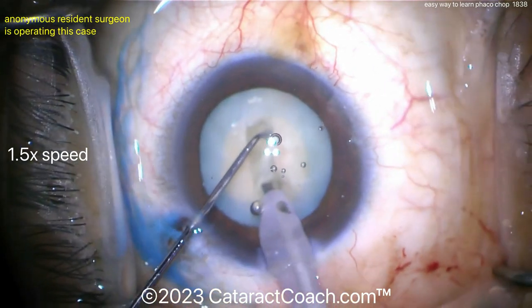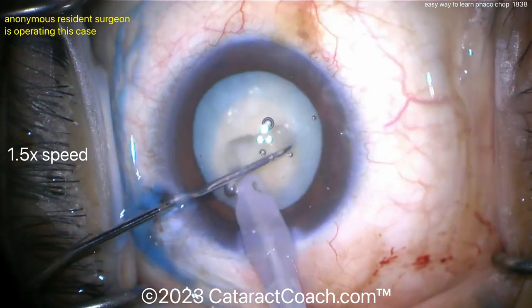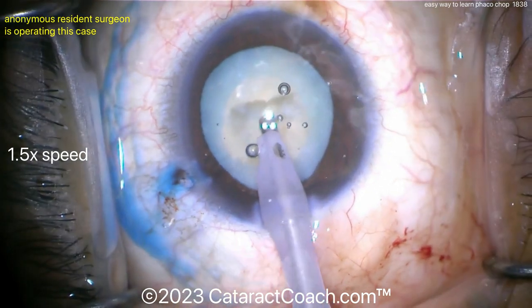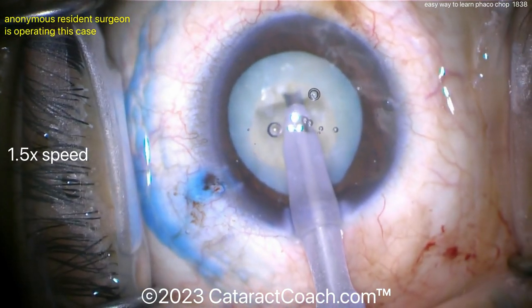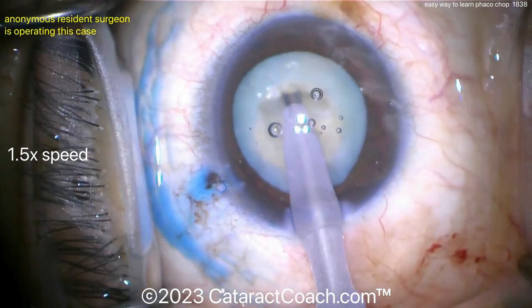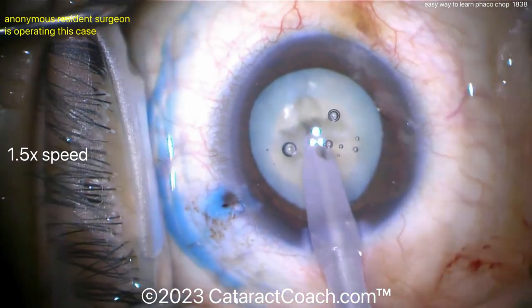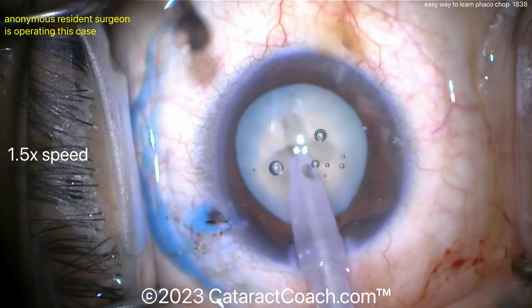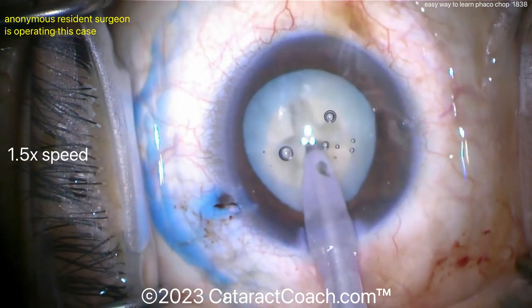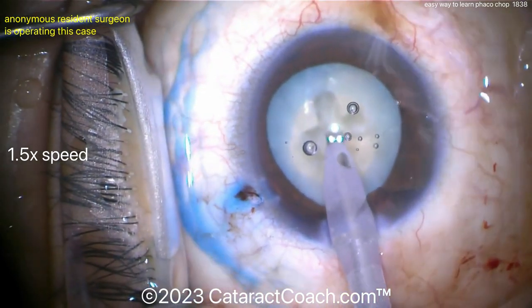You could even do a stop and chop here — we're just splitting it into two halves and trying to bring up each half. You can also rotate it and do a four-quadrant divide and conquer. Once you've achieved your four quadrants, each quadrant brought up to the iris plane can then be sub-chopped into eighths. Hold the nucleus with the phaco probe using vacuum power, then use the chopper to help break it up.